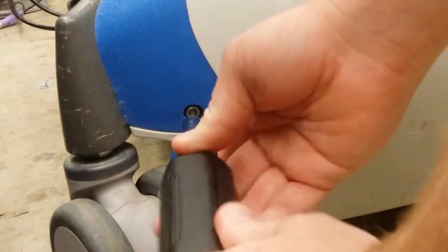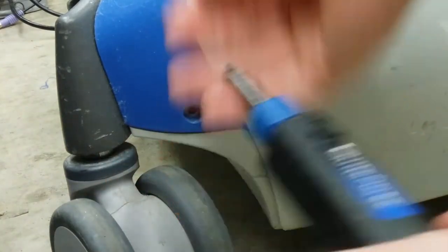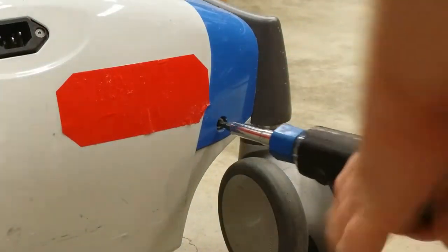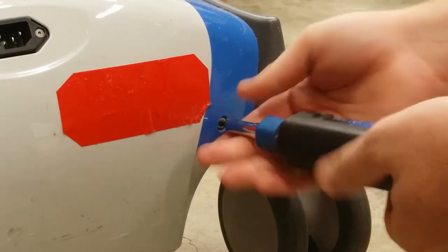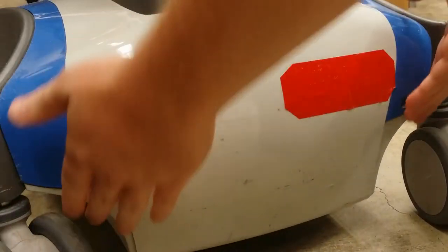First, remove the two screws on the back. Remove the rear cover.